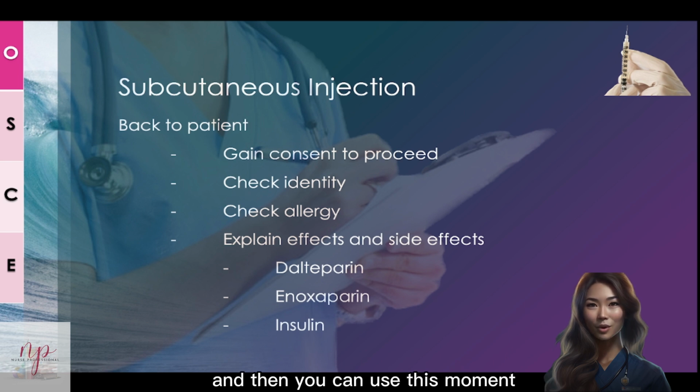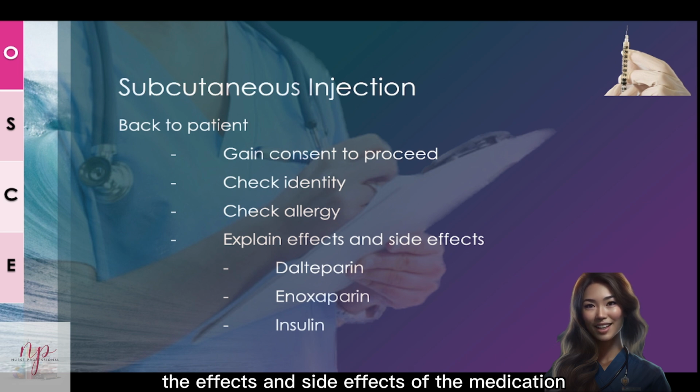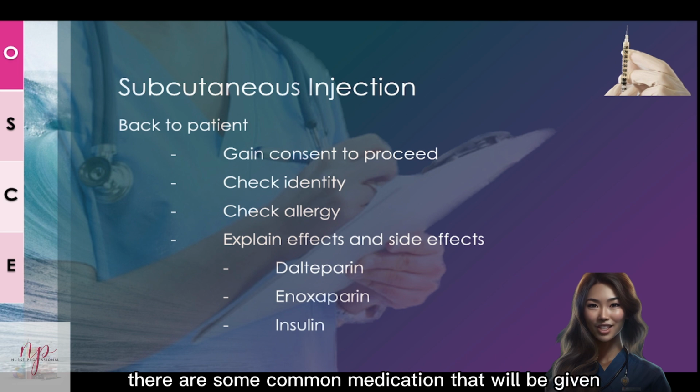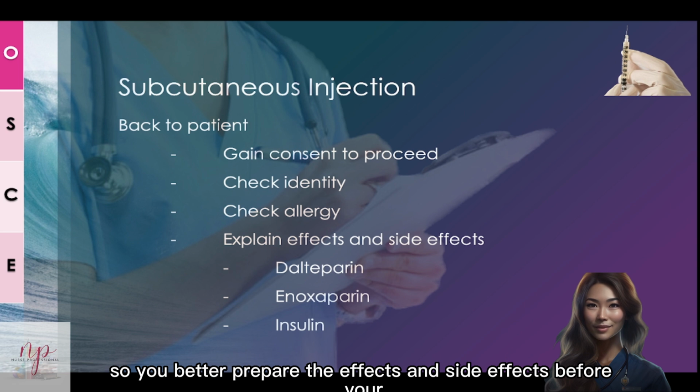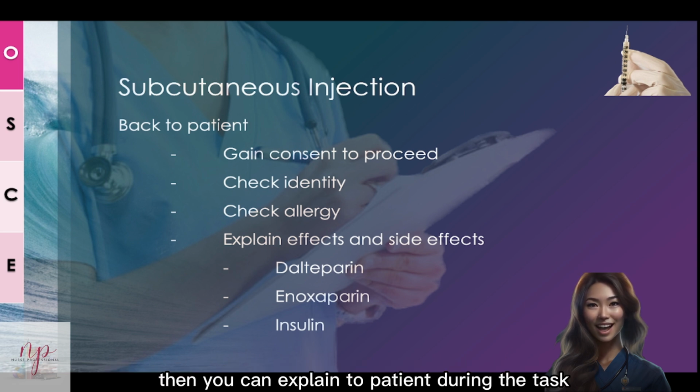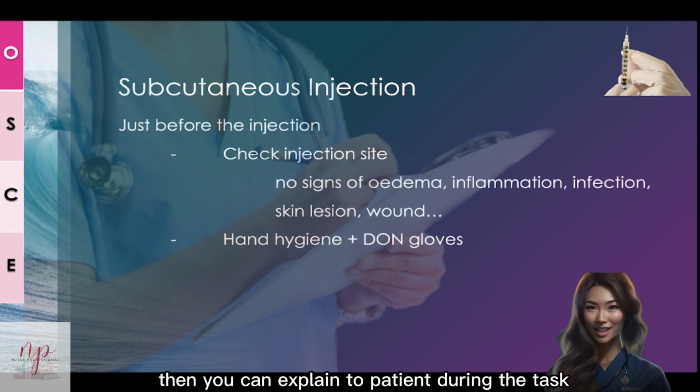And then you can use this moment to explain the effects and side effects of the medication. There are some common medications that will be given for subcutaneous injection, such as dalteparin, enoxaparin, and insulin. So you better prepare the effects and side effects before your examination. And then you can explain to the patient during the task.